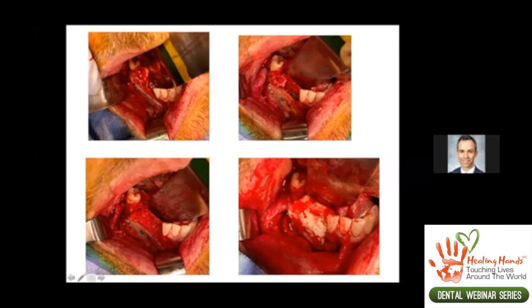What I did is I took basically a slab of cortical bone that I adapted, and I secured it with very small 1.0 millimeter screws, mesially and distally. Then I dissected on the lingual aspect and released the mylohyoid muscle a little bit, and I placed the lingual slab of bone and secured the buccal and lingual bones with 1.5 millimeter screws that are essentially engaging bicortically, kind of creating a sandwich. Then we use the rest of the marrow bone from the iliac crest. This is all autogenous bone to pack the defect. This way we're able to gain a lot of vertical bone height in a very predictable way.